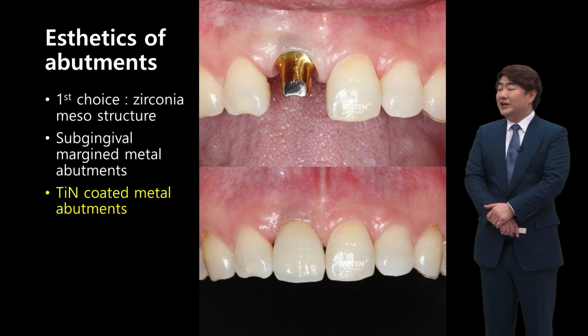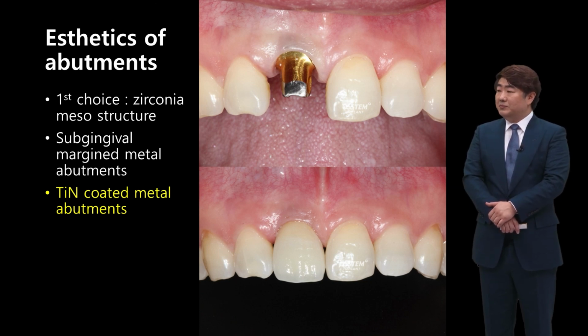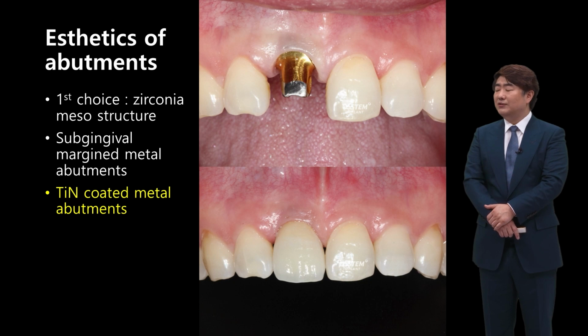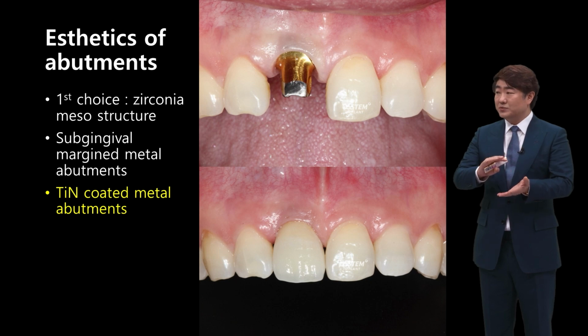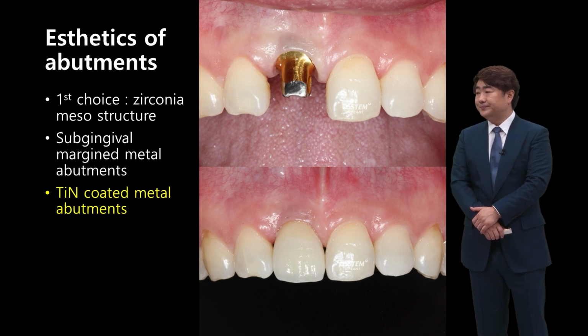And for this patient, it's not my patient, but gingiva looks rather thin. So rather than general abutment, titanium nitride coated gold colored abutment seems to be, compared to general metal color, negative impact from shadow is minimal. But still, there is still a bit of metal feel there.